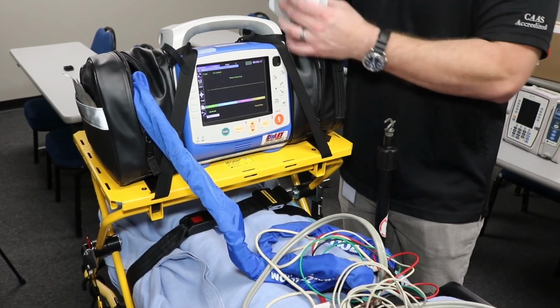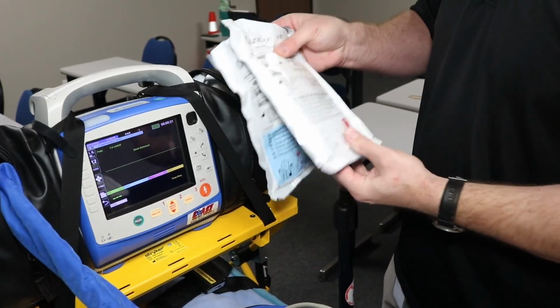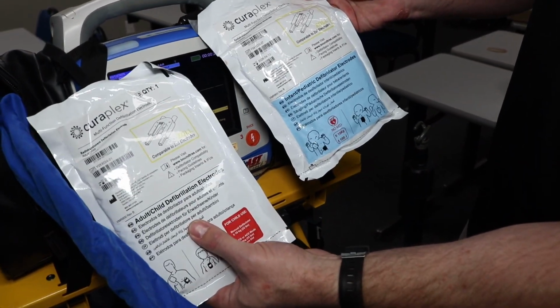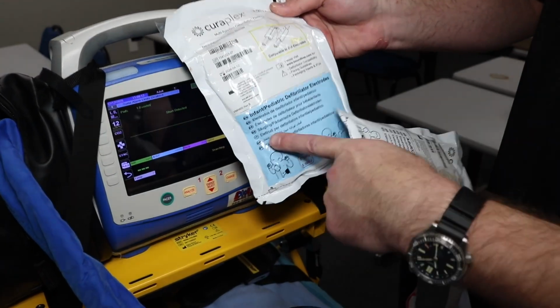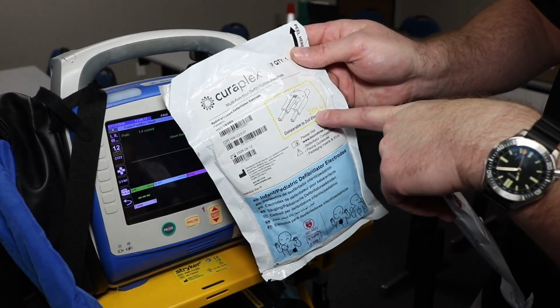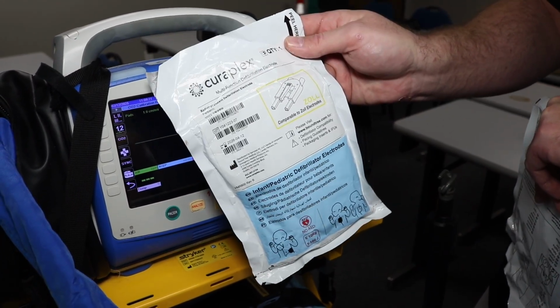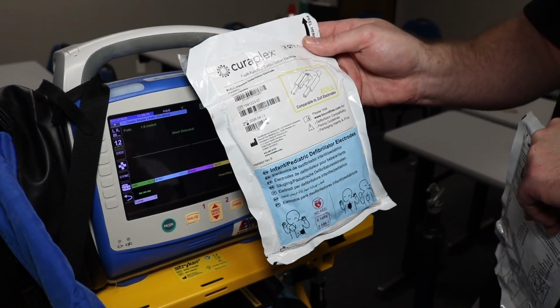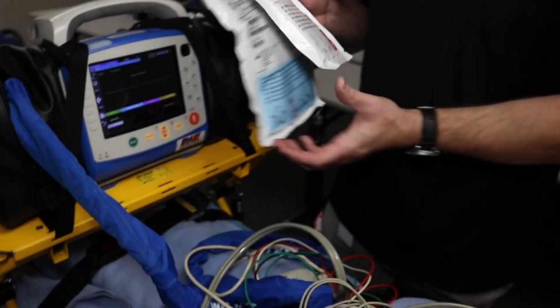In here should be a couple different types of pads. We will have pediatric and adult here. White is going to be for adults, can also be used for child. And then the blue is for infant and pediatric only. We want to make sure that the defib pads that we are utilizing say Zoll on it and not any other brand such as LifePak or Physio Control. These will go onto the patient and we will connect that.